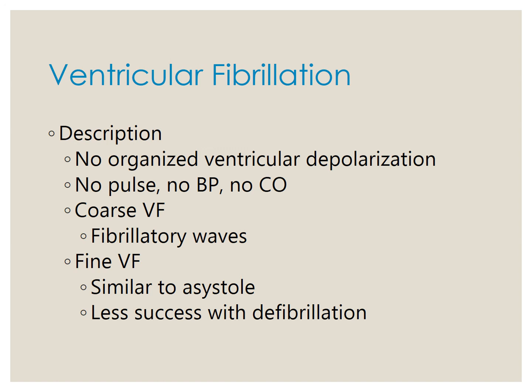Coarse VFib, the fibrillatory waves are more easily seen and are usually more easily converted by prompt defibrillation. So when they're looking like they're a little bit rockier and there's more going on, it's an earlier VFib that you caught them in. So if you shock them out of it, you have a better chance of shocking them out of it. When you see fine VFib, it looks a little bit like asystole, and it's more difficult to have a successful resuscitation because, again, their heart is actually kind of going to where it's about to stop.